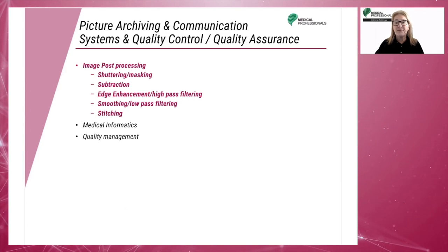Digital imaging systems have greater dynamic range than film screen systems. The greater dynamic range allows for many more shades of gray to be captured by the image receptor and possibly displayed on the monitor. Along with the greater dynamic range, the capabilities of computer software allow digital image data to be manipulated to enhance anatomic structures, suppress noise, and adjust brightness and contrast.